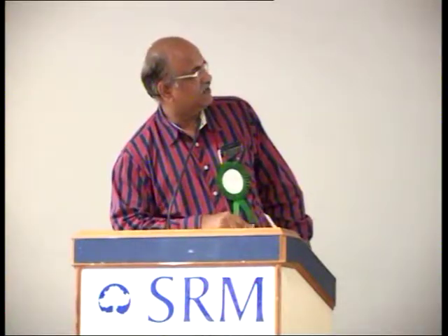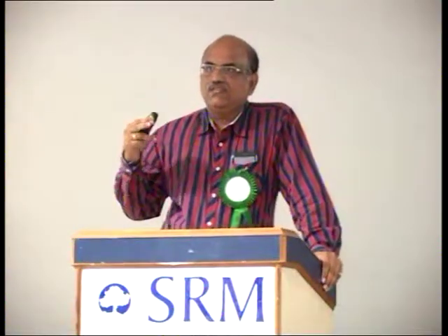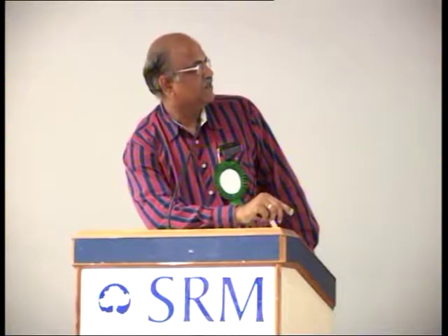What we are doing in NAVA, neurally adjusted ventilatory assist, is a new technology. We are inserting a catheter. This catheter will take the signals from the diaphragm. Once the neural signal reaches the diaphragm, it will be fed to the machine. So we are bypassing this process, which takes longer time, and we are delivering the flow immediately when the patient initiates the breath. So this reduces the asynchrony.